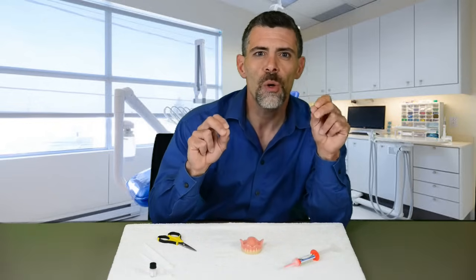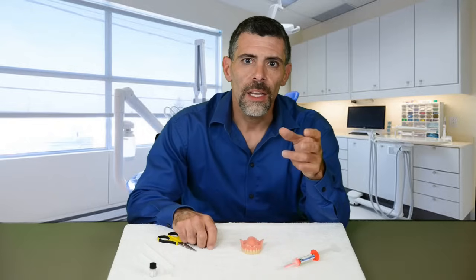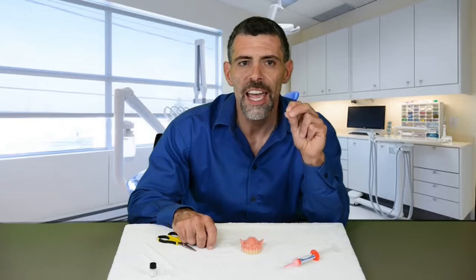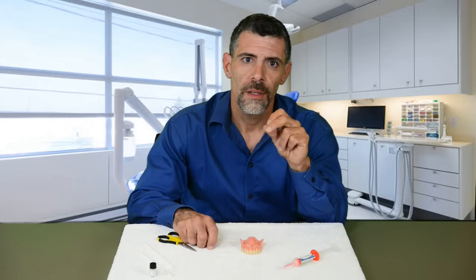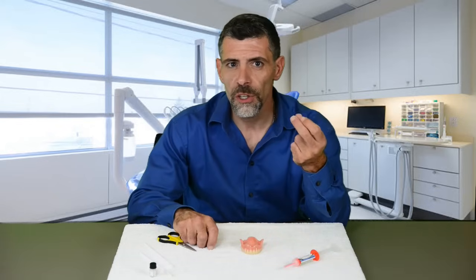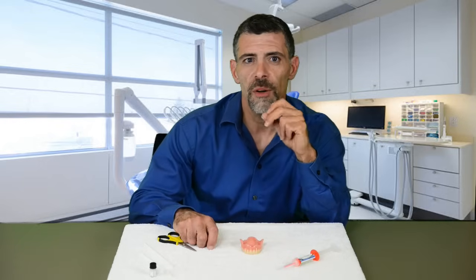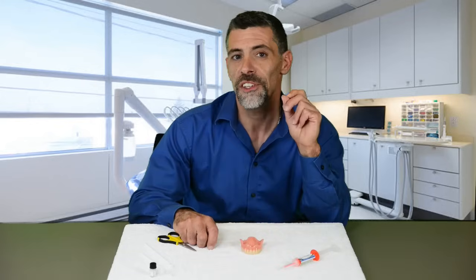Any breaks in your seal will allow air or liquids in. So ideally you want complete, even flashing around the edges of your denture. When should you trim? Trim if the silicone is loose, hanging, or uncomfortable, or if you can see it when you smile. Do not trim flashing if it feels comfortable — this contributes to a good seal.